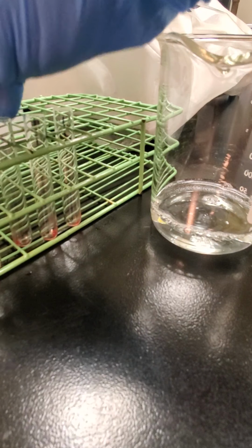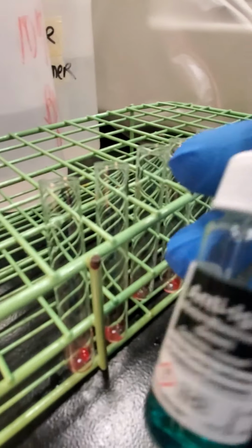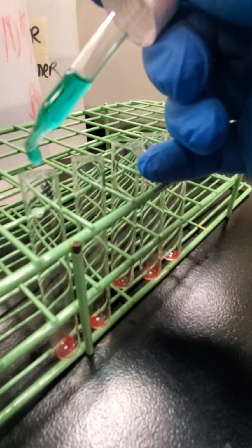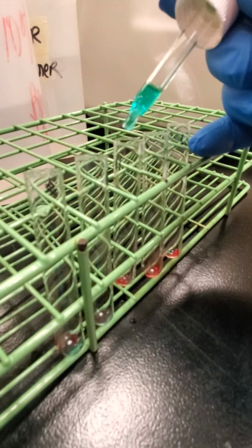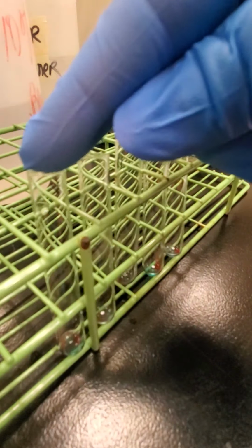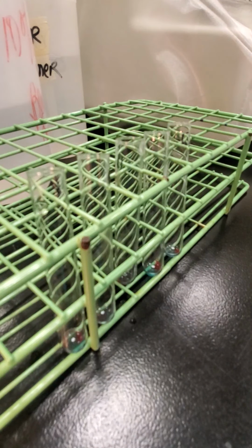So now I'm going to add my IgG reagent. Two drops. This is just like an antibody screen testing or any panel testing with PEG methodology. This one did not have any enhancement, so that is treated like our weak D. Okay, so I've added my 2 drops of IgG. So I'm going to put these into spin for 15 seconds. I'm going to put those in. I'm going to shake them.